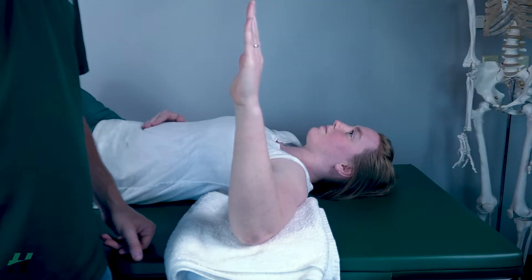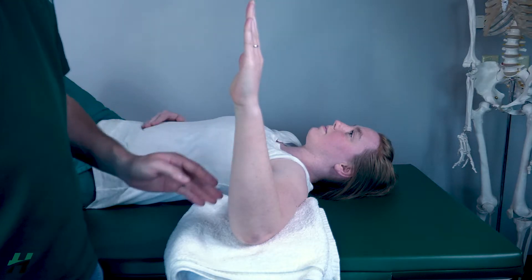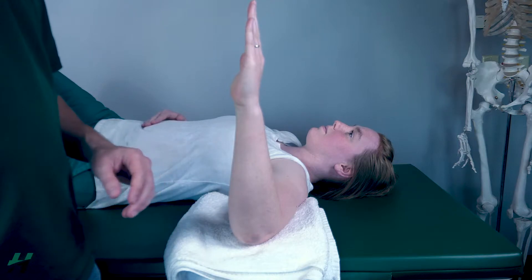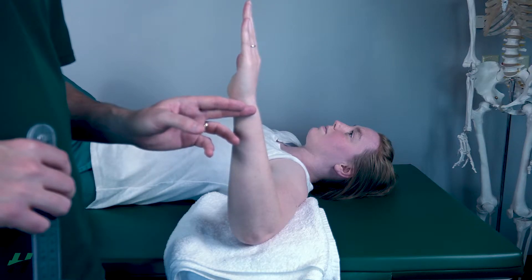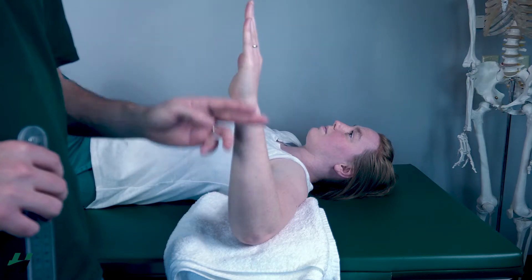Measuring shoulder external rotation, the patient will be in a supine position with the shoulder and elbow at 90 degrees while being supported. The axis of your goniometer will be on the olecranon. The movement arm will follow the styloid process of the ulna, and the stationary arm will be perpendicular with the ceiling.